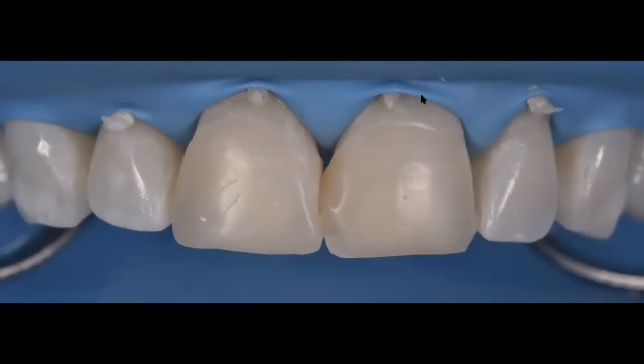Because as you can see in this photo, I have been able to heavily retract the tissue. I have a lot of untouched or uncut enamel available to me. And I'm not going to go all the way up there. I'm just going to remove whatever composite the patient has, but I want you to see how much tissue you're able to displace and how much you are able to invaginate that rubber dam within the sulcus and keep this area nice and clean without any debris, any bleeding, or any crevicular fluid affecting the areas that you're going to be working on.